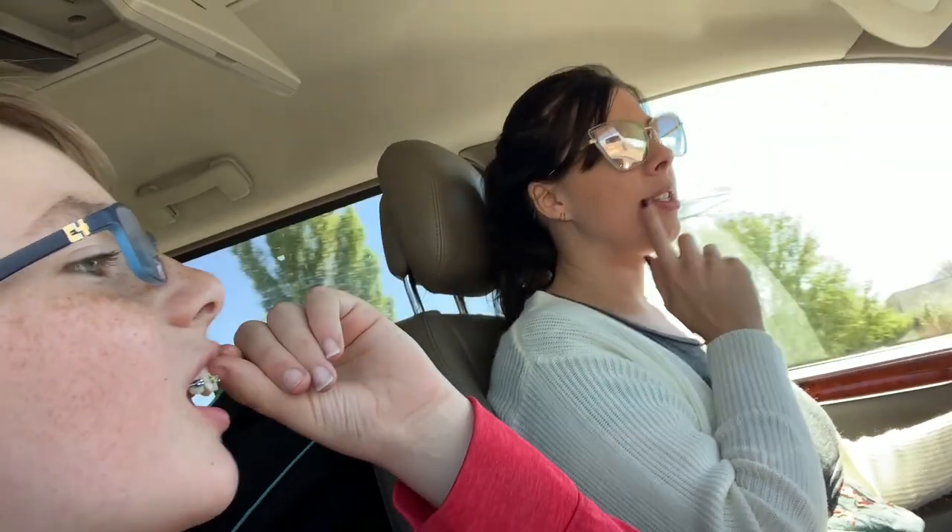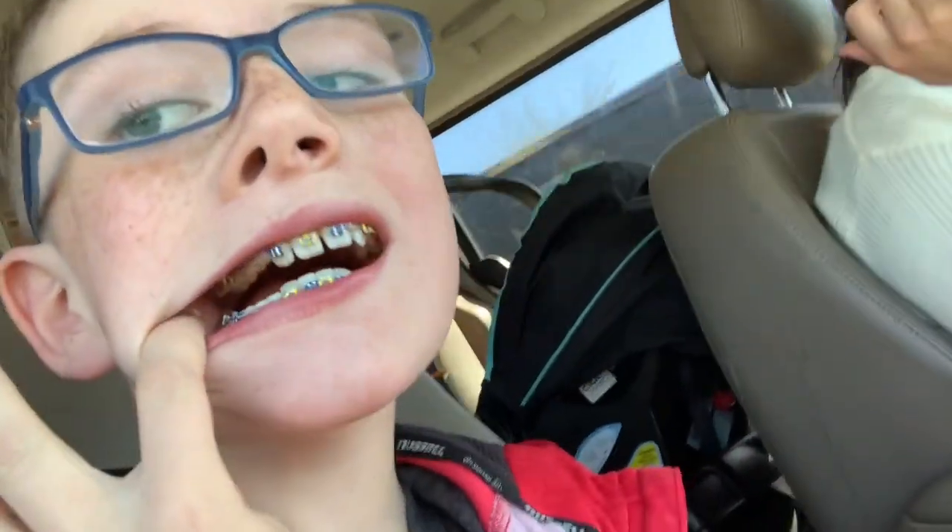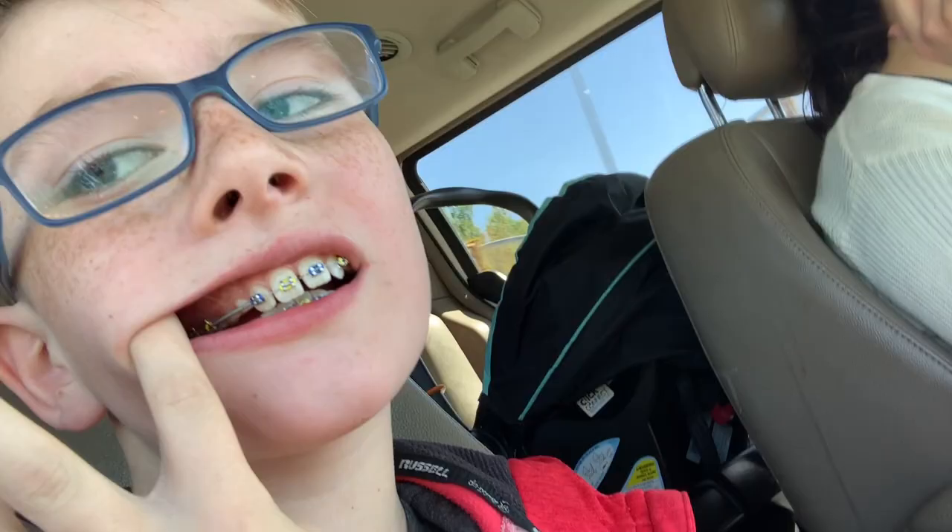So they opened up his mouth with some spreaders, dried his teeth, then glued and cured the pieces on, put the brackets on and put some springs. They did the front four and then the back two on each side, so there's a bit of a gap in there on the side — because those teeth are baby teeth. Anyway, it's super exciting and that's how it's going so far!